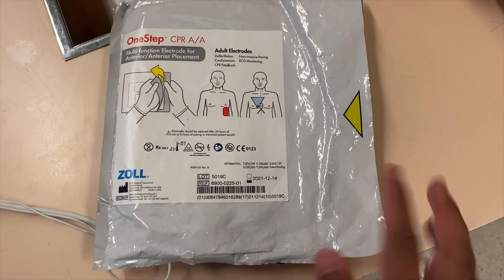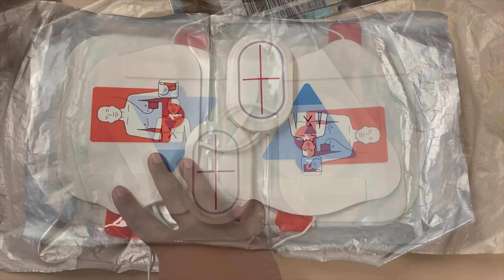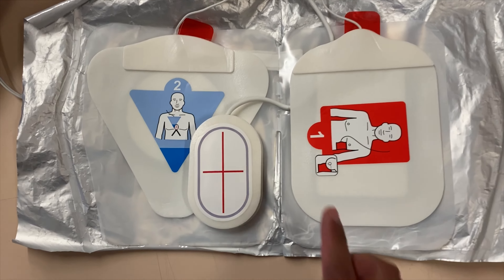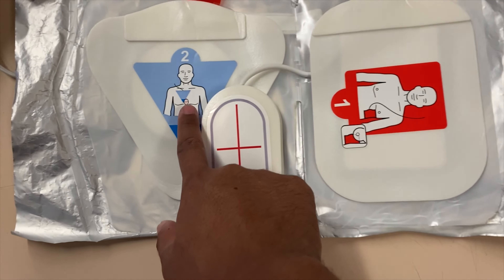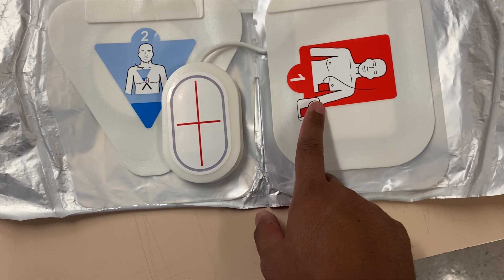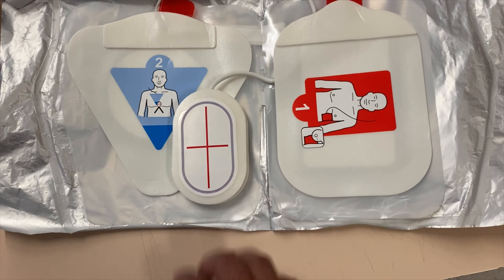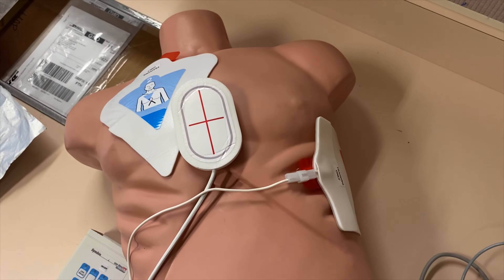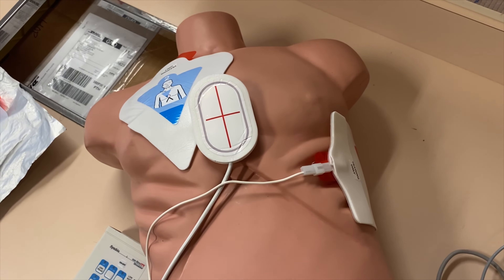This is the Zoll defibrillator pad. When you open up the pads, it would actually look like this. It's easy to follow — just make sure you look at the diagram and how to place it. It will be over here and one on the side. You'll notice that there is a puck. This will serve as your CPR feedback device. Once you have correctly placed the pads, it would look like this on your patient.